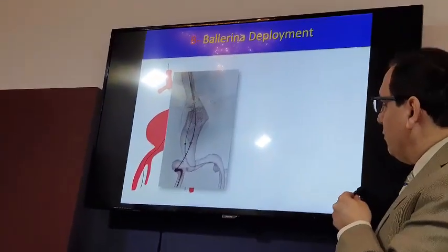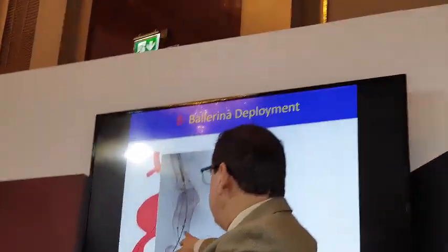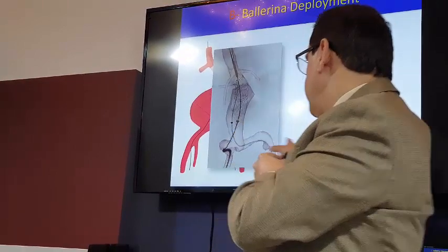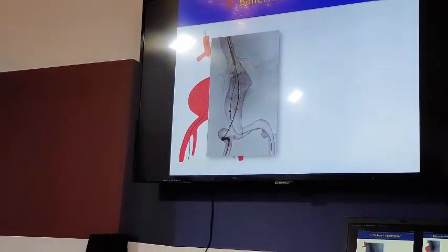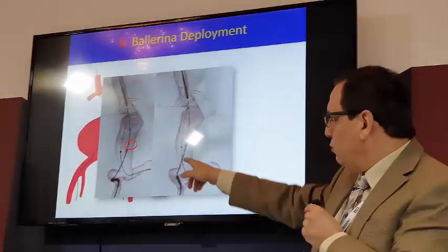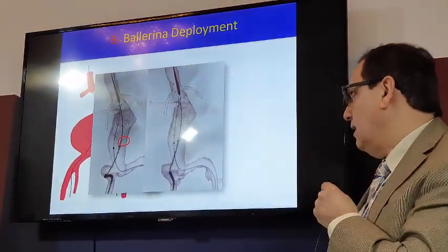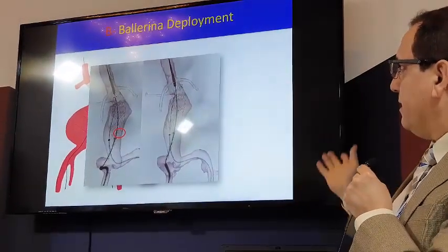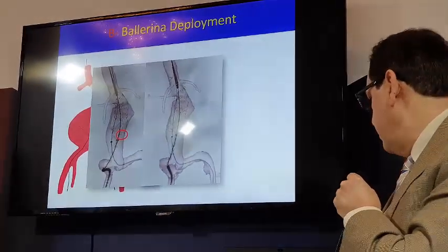So what happens is that if you deploy it in the standard situation, where this is the right and this is the left, then your gate is here and your catheter is here, it will be very hard. So in this situation, it's better to put it in the ballerina position, like that, and then it will become a very easy, straightforward shot to the cannulation. So you decide to go standard or ballerina, it depends on the anatomy of the aneurysm.